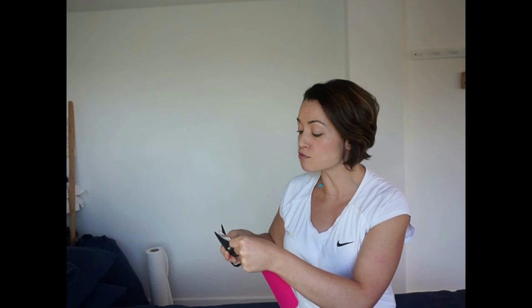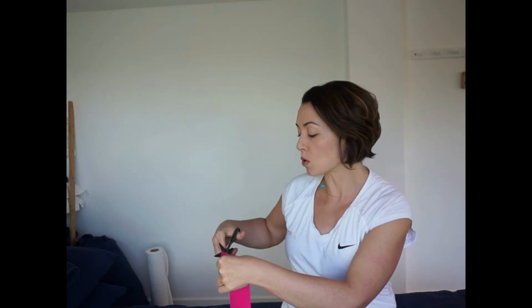The next key point is about rounding the edges, so taking your scissors and just creating a rounding rather than the sharp corners of the tape. And that really does make a big difference in terms of the durability and the longevity of your taping, because it stops it catching when your client puts their clothes on and takes their clothes off.